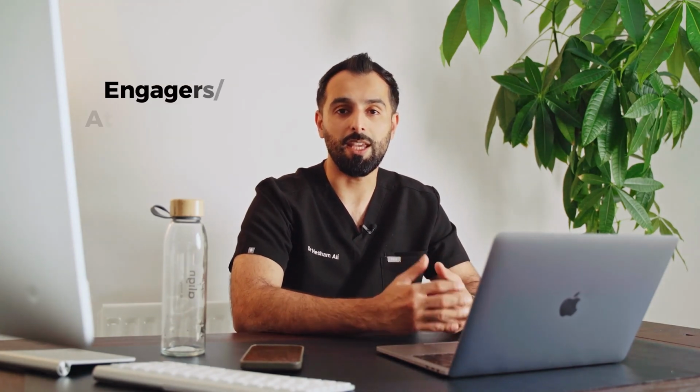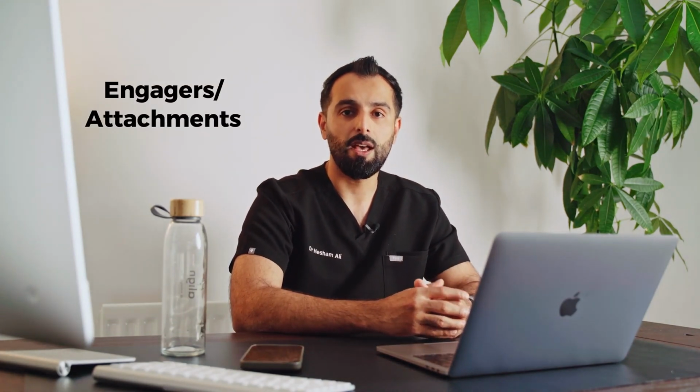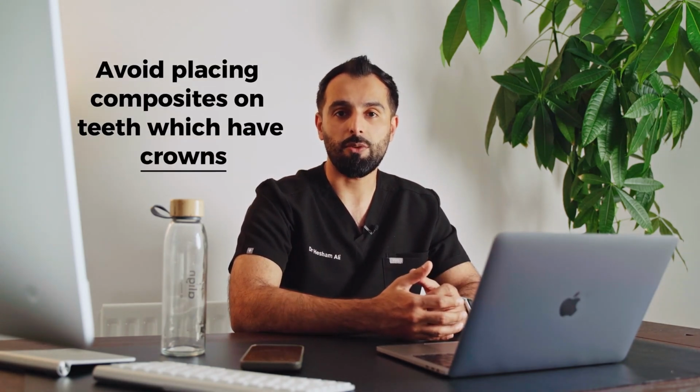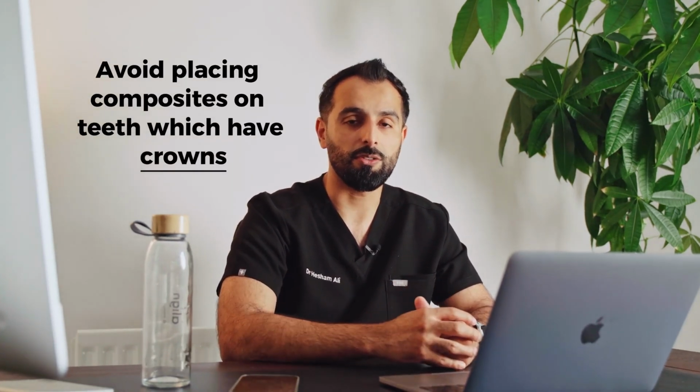And similarly, try to identify as well if there are any teeth on which you don't want to have any engagers or attachments placed. I often will try to avoid placing composite on teeth which have crowns because I know the bond strength is not as good. If it comes off repeatedly, then the patient has to come in for repeated appointments.